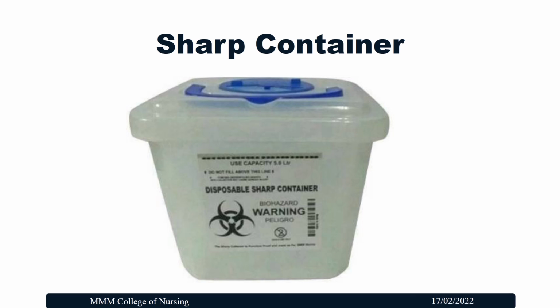Whenever performing injection and infusion procedures, remember to have sharp containers with you, because they facilitate the immediate disposal of sharp items. By that we are able to prevent sharp injuries.